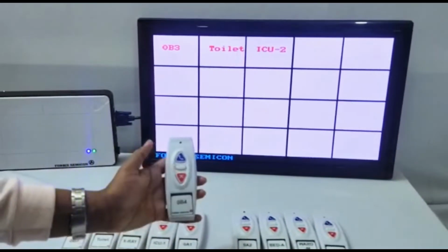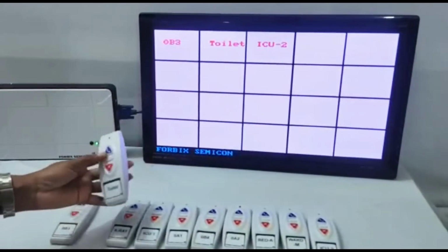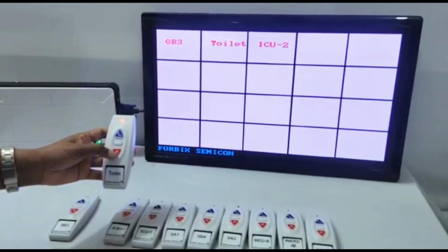Once the attendant has serviced, he or she needs to press the bottom button to withdraw the call from the queue display.